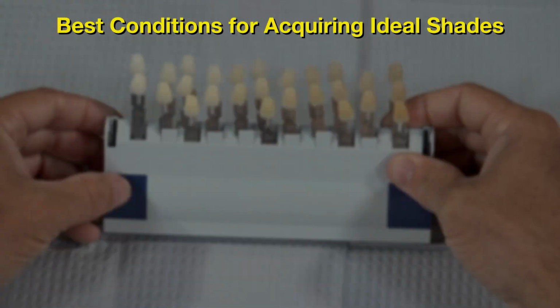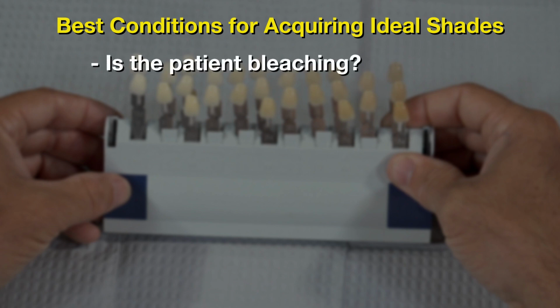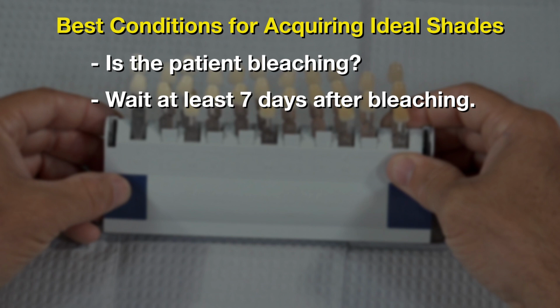Before starting the shade taking process, we need to know if the patient has been bleaching or is continuing to bleach. Now, it's recommended to wait at least 7 days since the last bleaching treatment has been administered. However, a full 2-week waiting period would probably be more ideal. This is due to the rehydration process and the possibility of the teeth bouncing back to a lesser shade. Now, once you are certain that the shade will stay constant, you can continue with the shade process.